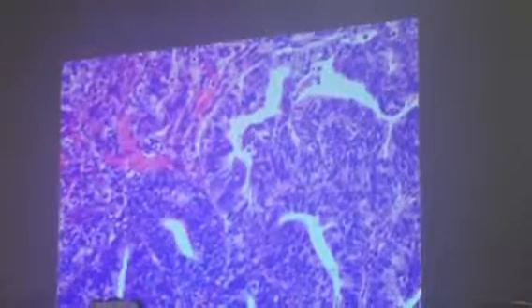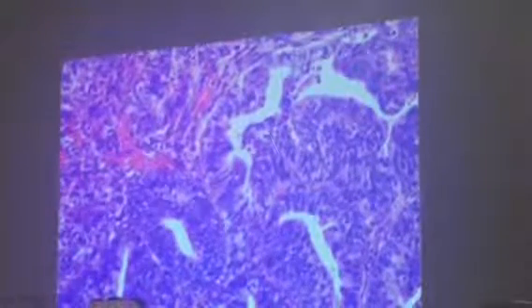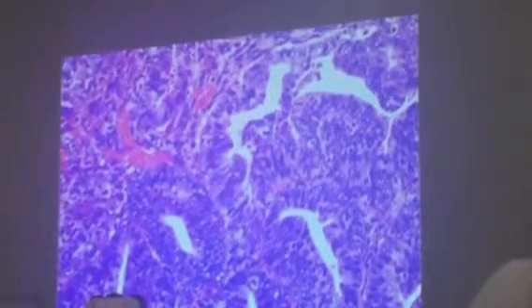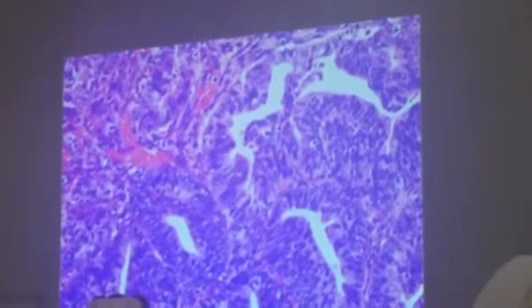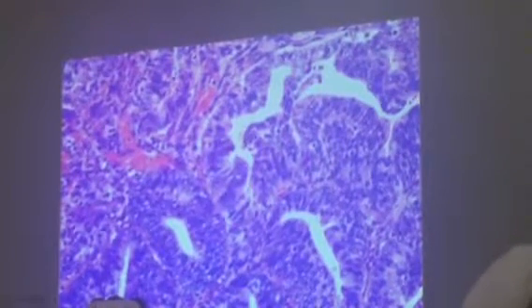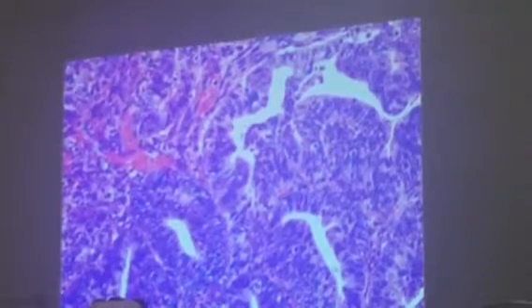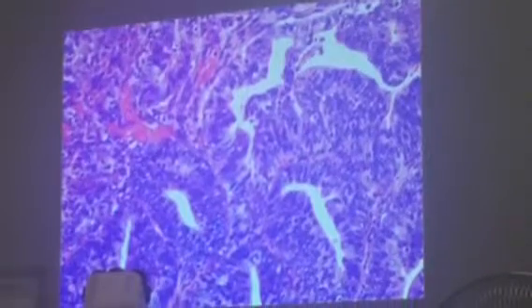Tapos lalo na pag nagiging clear yung nucleus, it becomes more visible, it becomes lighter in color. So that's a vesicular shape. Okay, a vesicular characteristic, meaning nakikita mo yung loob ng nucleus, and therefore the nucleolus and the chromatin become more visible.